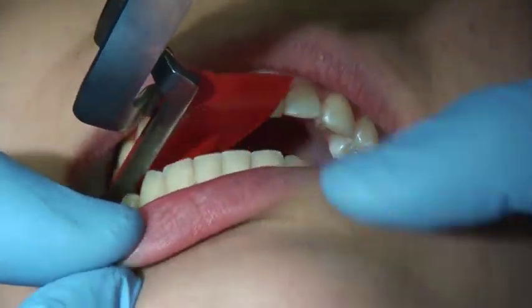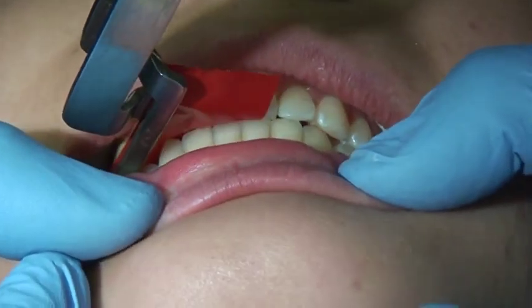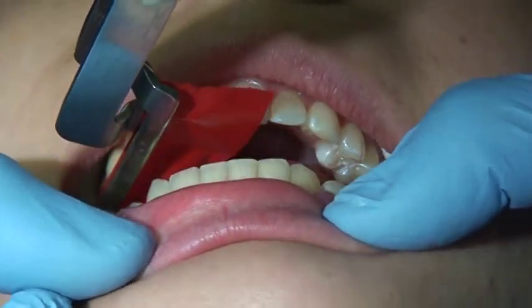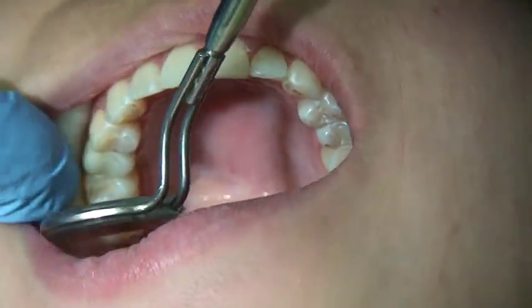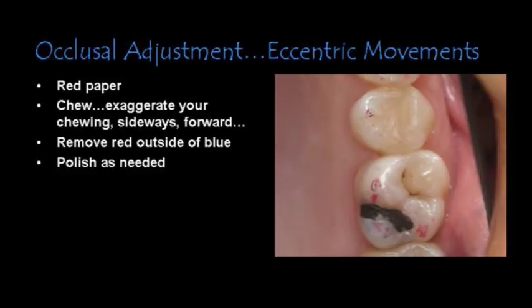And I like to tell them to exaggerate the chewing and go as far as they can go to the sides and as far as they go forward. So that way I get really good marks, and any red that is outside of the blue centric mark has to be removed and adjusted. Otherwise, we will have interferences, and that will cause future fractures of restorations or post-op sensitivity.